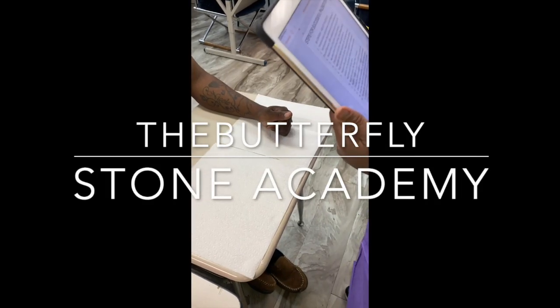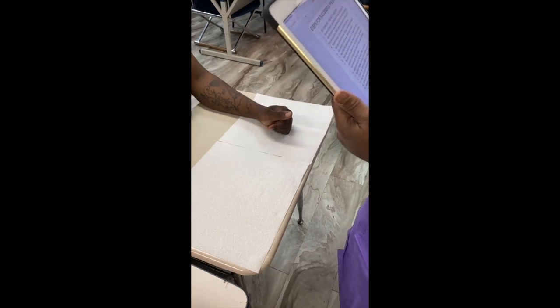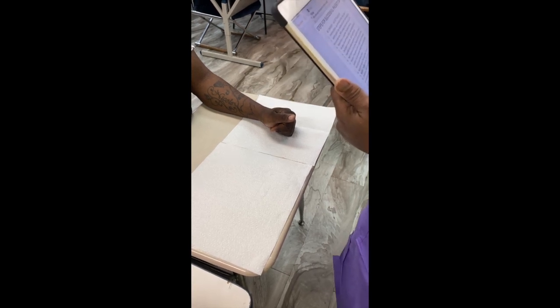Good morning, my name is Monica. I'm your phlebotomist for today. I'm here to draw some blood work on you that was ordered from your doctor. So first, give me your first name, then your last name, and your date of birth.